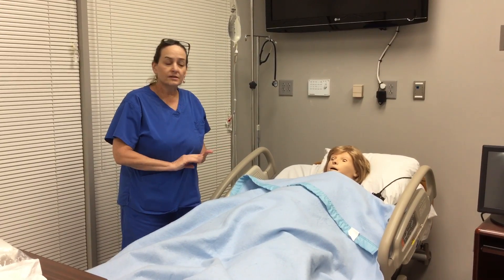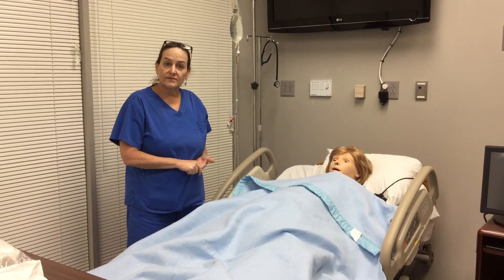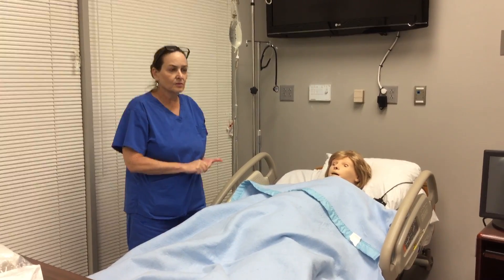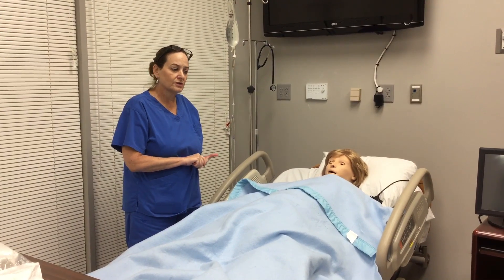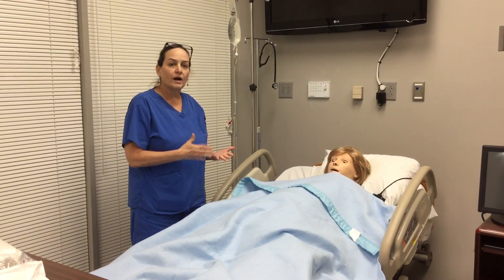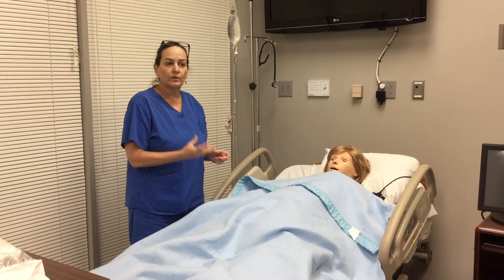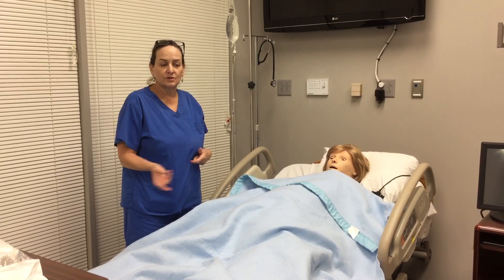They will not feel it, so you can reassure her — because of the epidural, she will not feel the insertion. She may feel touched, maybe a little pressure, but usually they don't feel much. You can reassure her and explain why you're putting the catheter in: that she won't feel the need to empty her bladder and we want to create space for the baby to move down.